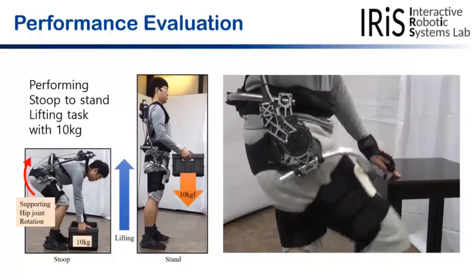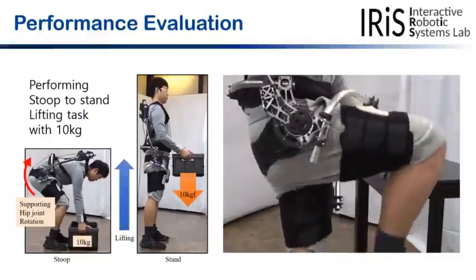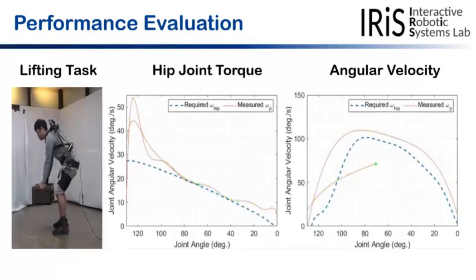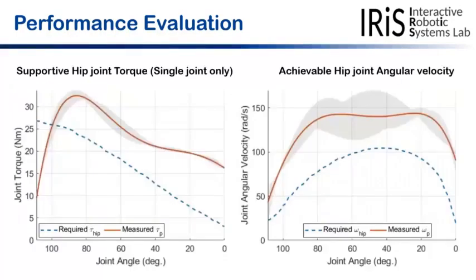The wearer manually controlled lifting and lowering sequence with the controller. During the experiment, the wearer performed stoop stand motion with 10 kg load holding in their hands.